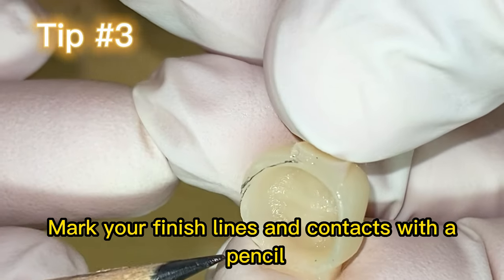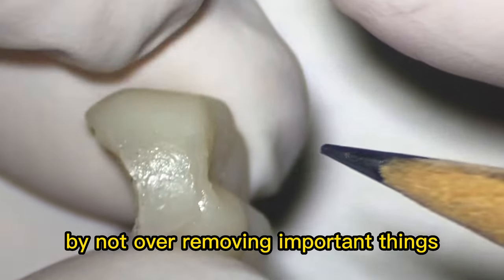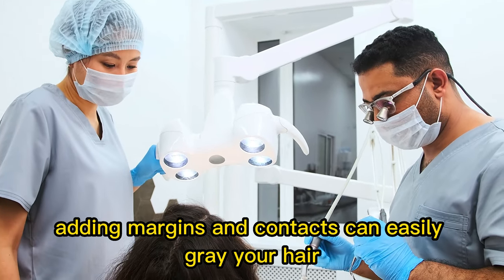Tip number three: mark your finish lines and contacts with a pencil to make your life easier by not over-removing important things. Adding margins and contacts can easily gray your hair.